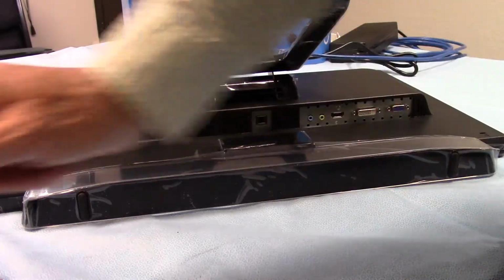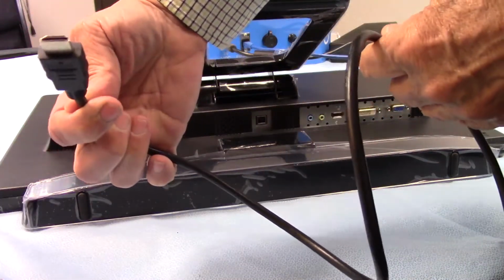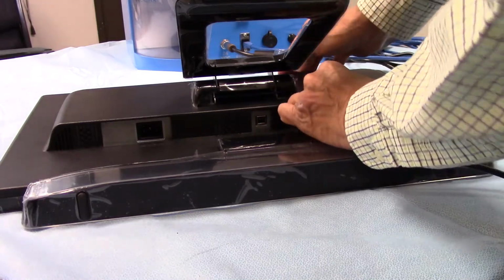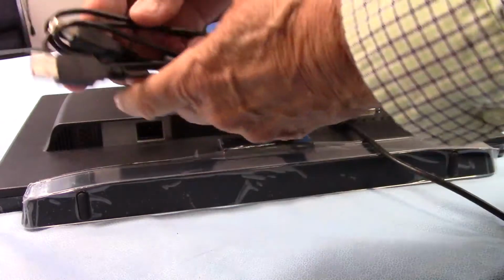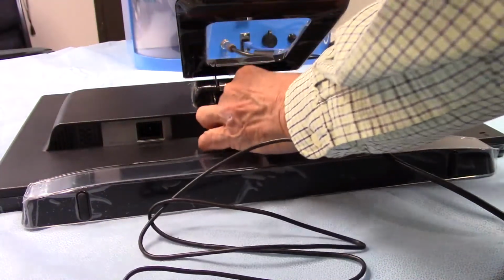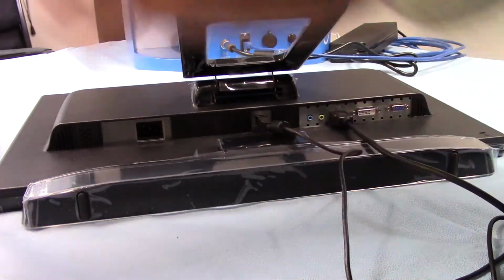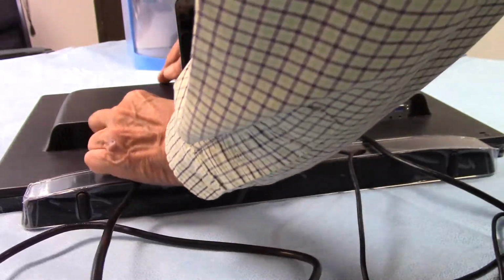There are three cables that we're using to attach to the monitor. The first one is the HDMI cable. Although we can use other video formats, the HDMI is the one that supports all of Califia's functionality. The second cable is the USB. The USB cable is actually the one that transmits the touch information from this monitor back to the computer. And lastly, I always hook up the power supply last, just out of habit.